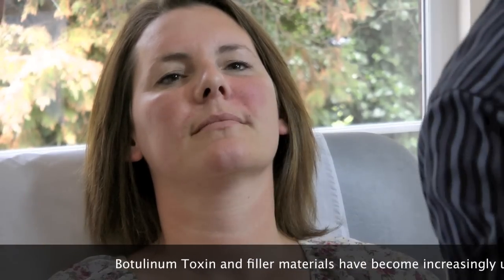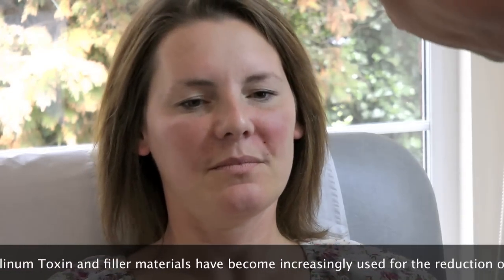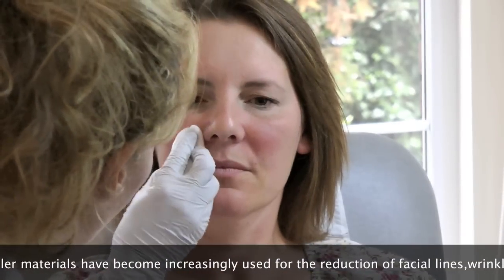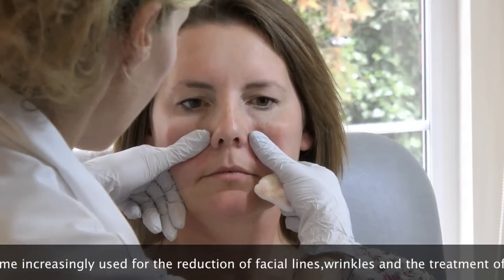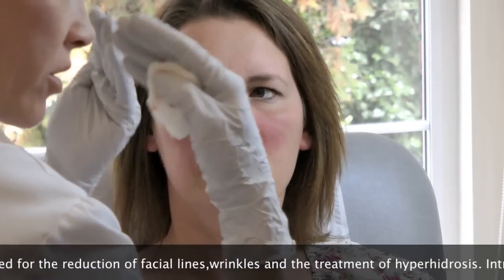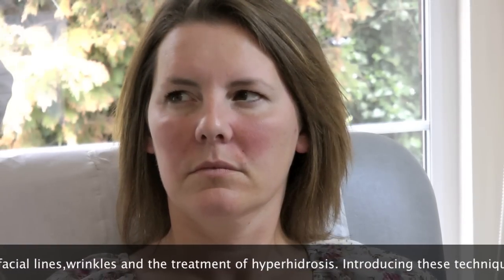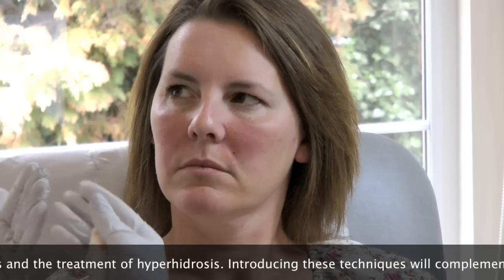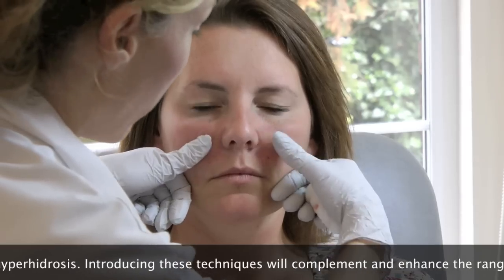Big smile. That's the movement you do if you had a product that had gone up into the cheek. And sometimes if somebody's very expressive, after a couple of weeks you'll feel that it's moved up a little bit — and then you can show them that if it goes up they can actually bring it back into that fold area.